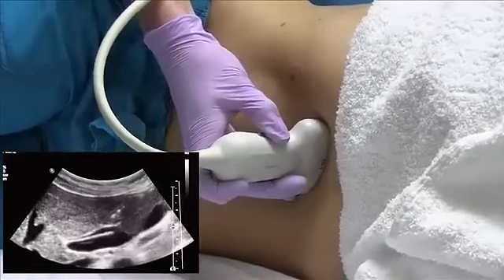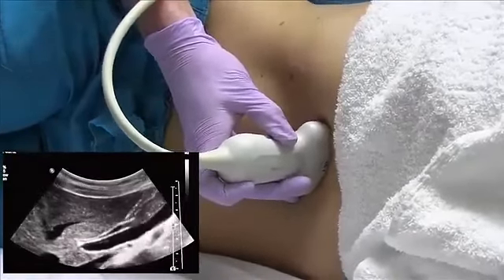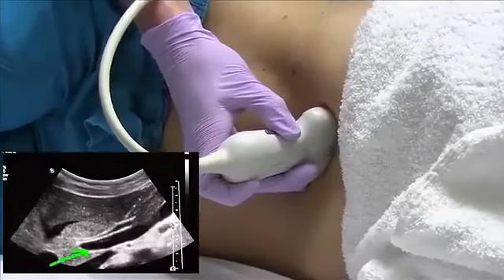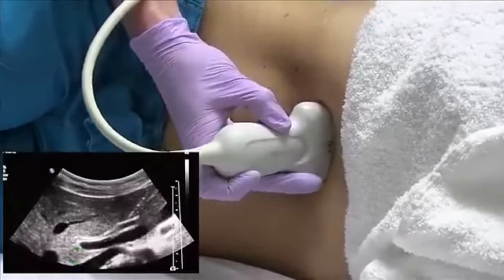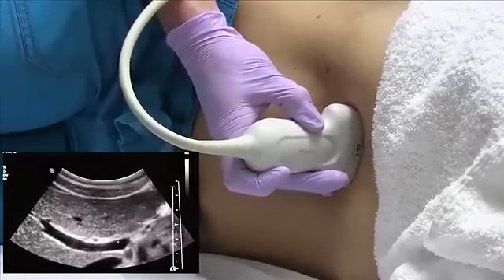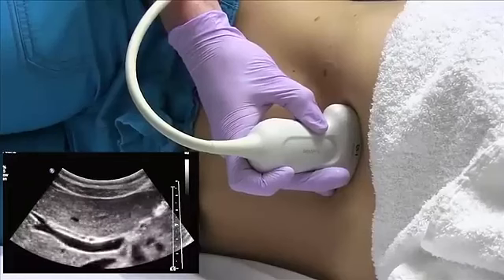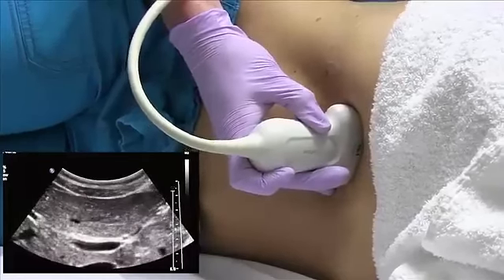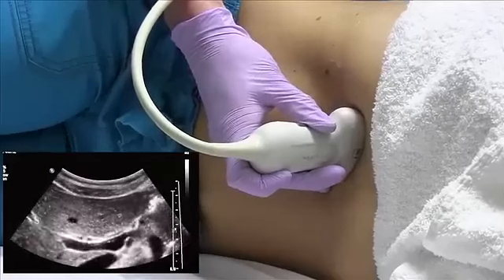For this, you want to elongate the main portal vein, and you'll see it track right up into the liver. Once you find that, you know that the CBD and the hepatic artery are right next to each other here.